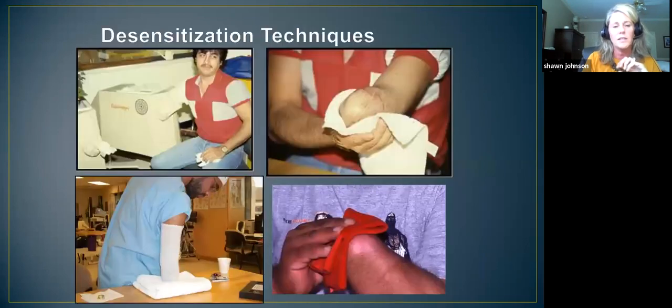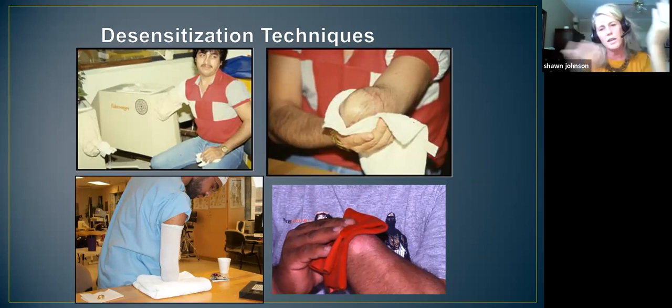And then for desensitization techniques, this thing over here is just a fluidotherapy machine, which is like dried corn husks that fly around someone's limb inside of a heated chamber. We do weight bearing, and we rub different textures around the residual limb. So the nerves in someone's limb, as you're aware, are used to traveling to the ends of their fingertips. When we're desensitizing, we're trying to train the nerves to the new set endpoint, wherever that may be.